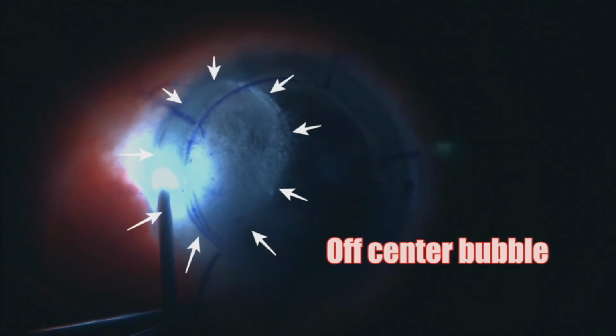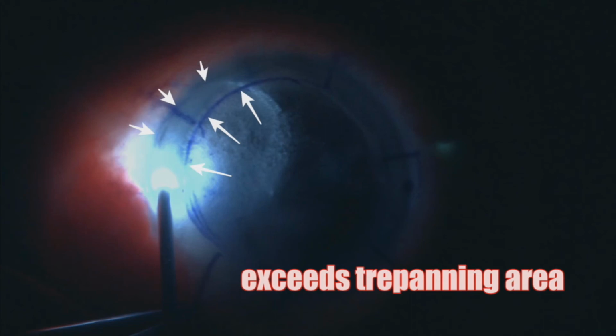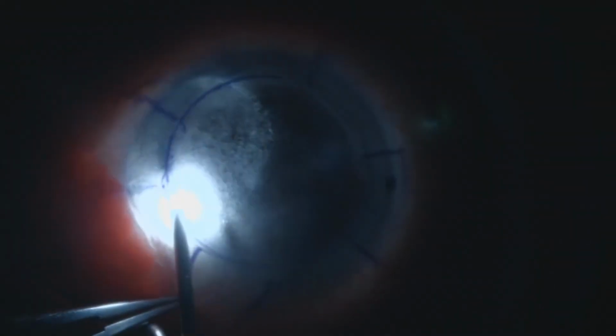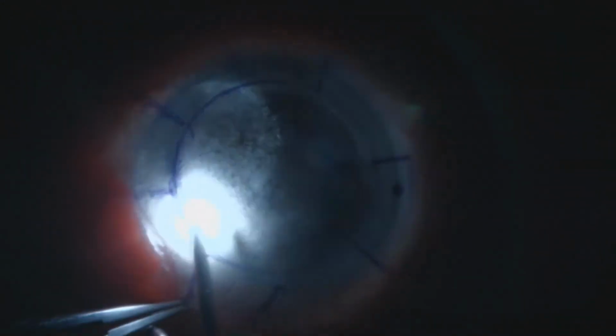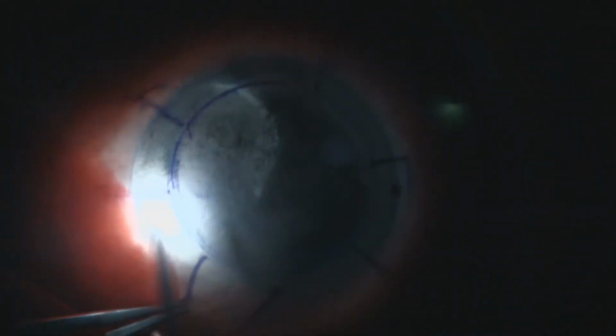The bubble is off-centered and it exceeds the trepanning area. The transillumination technique shows the waning moon sign, revealing the inner reflection of the light when checking with the light probe.